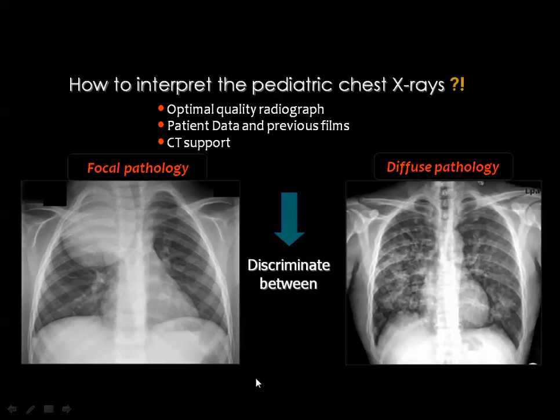And actually, these criteria cannot be easily achieved in the pediatric patient, but we'll try as much as we can to have a good quality radiograph.